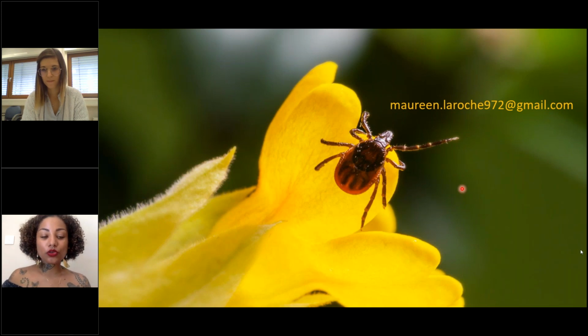Yes and no. So basically what happens is that we are collaborating with other research groups by hosting their students to be trained in my past laboratory. This is how we ended up having so many different samples from so many different countries, because we have someone coming from an exotic place and asking to be trained on MALDI-TOF, and that's how you generate those reference spectra from those species where this person is coming from, and then they can just leave with the database they've created.